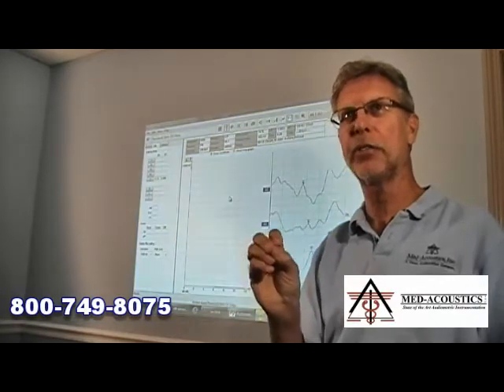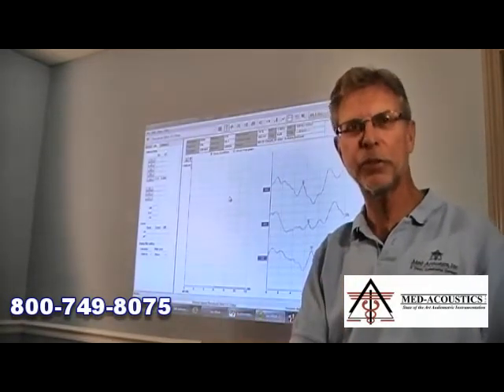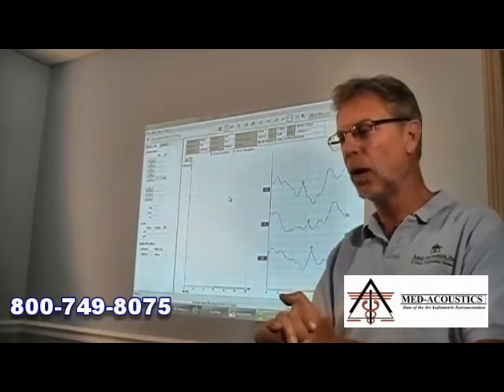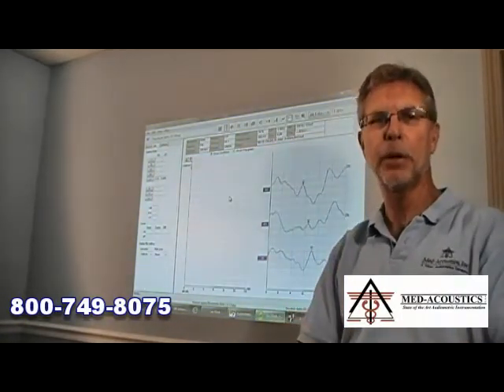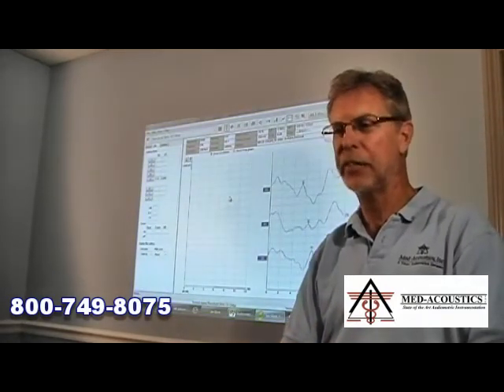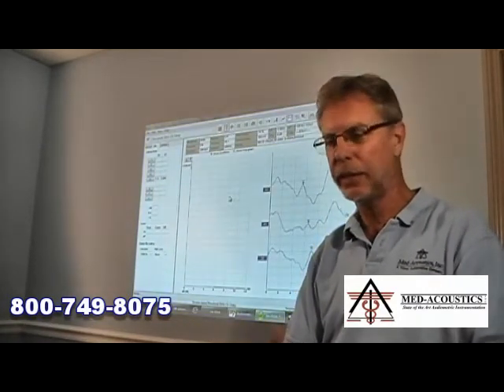The sensitivity can be raised to 82%, research shows, by measuring the area ratio as well as the amplitude ratio. So that's a feature that's in the Eclipse as well. So as far as I'm concerned, those are the main things that make the Eclipse one of the most compelling systems on the market today. I am also on their advisory board on the next version of software that will be released sometime next year for the Eclipse, and there will be several changes made to make its operation even easier than it is now.